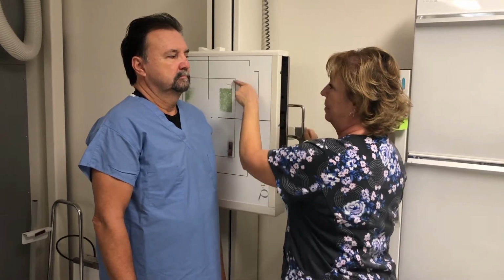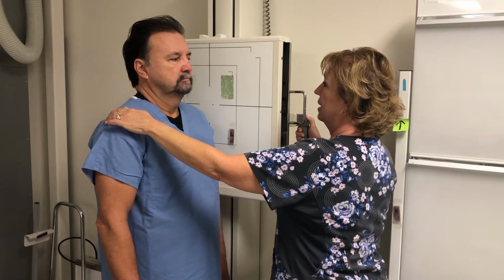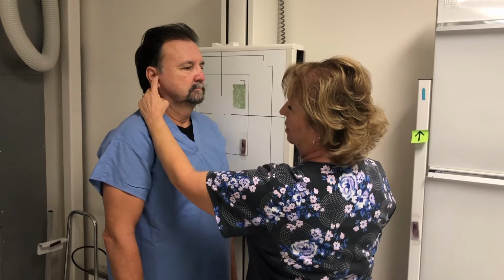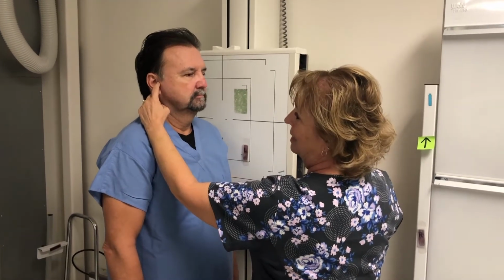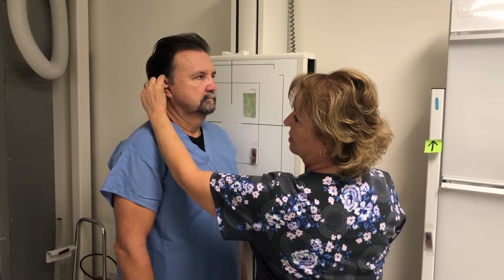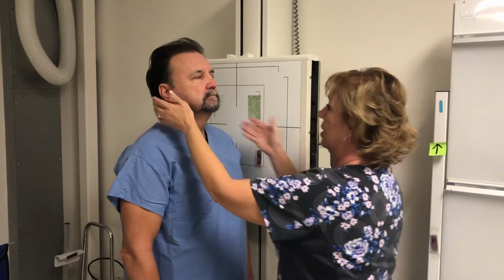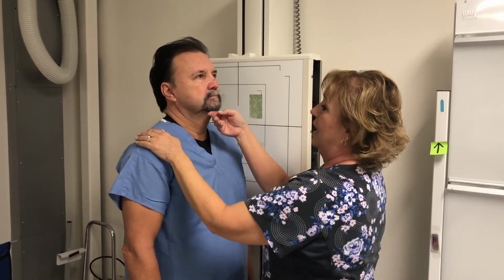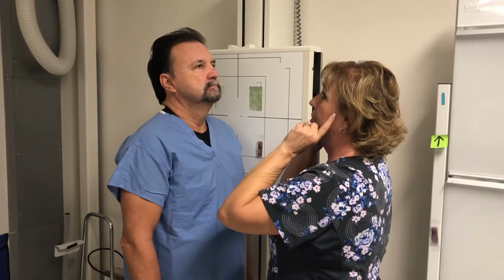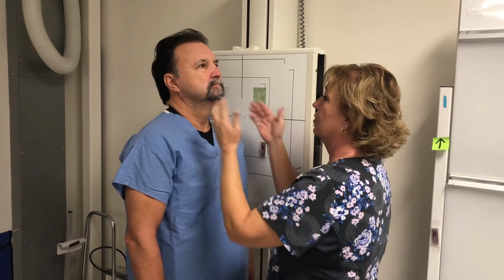I'm going to put the top of my IR about 1 inch above his EAM. That stands for external auditory meatus. So the upper border with his ears, I'm going to put about level with the top of his ears is where I'm going to have this be. I'm going to elevate his chin because I want the back of his mandible to come off his first two cervical vertebrae.